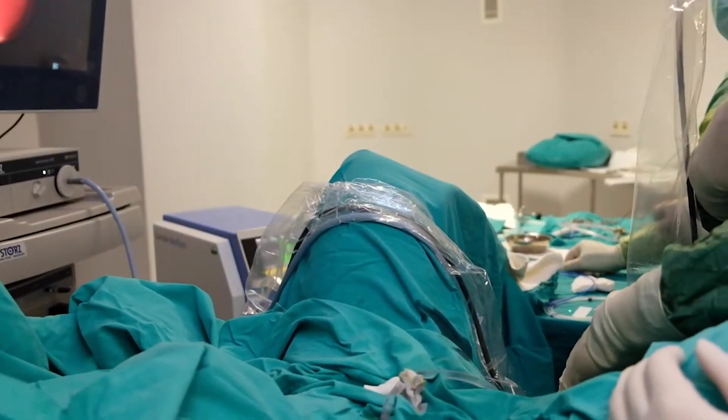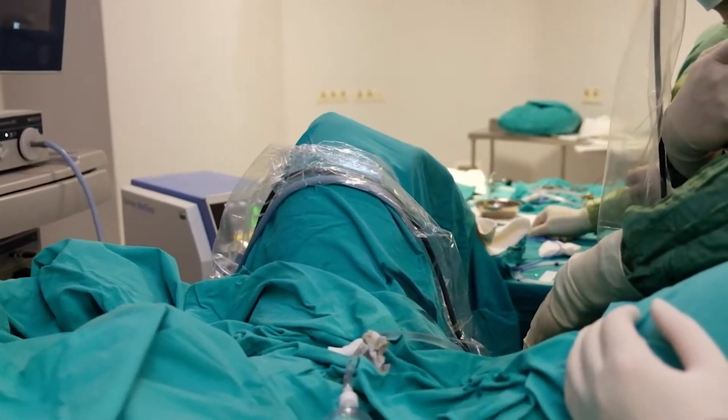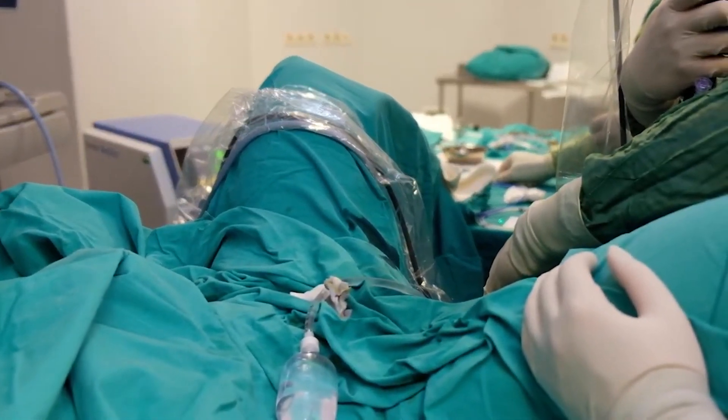Today we are performing endoscopic laser stone treatment for left kidney stones. When we look at kidney stones, they generally present to the hospital with severe pain, bleeding in the urine, recurrent urinary tract infections, and occasionally with renal dysfunction. In general, we accept stones over 5 mm in the patient group that need to be treated, especially with some kind of surgical treatment.